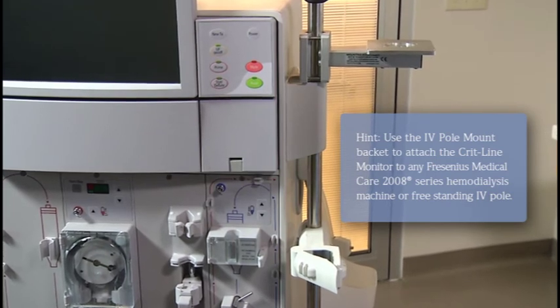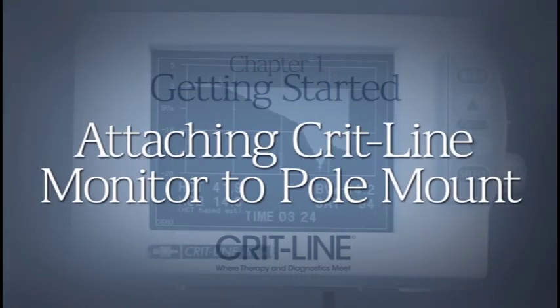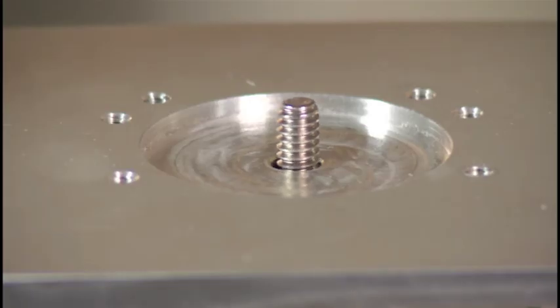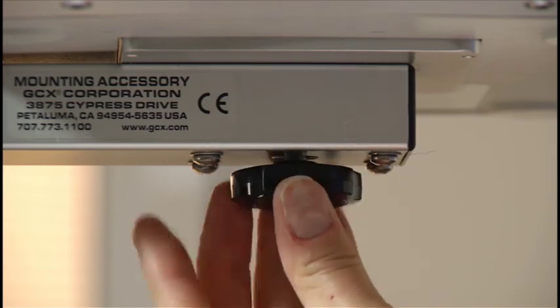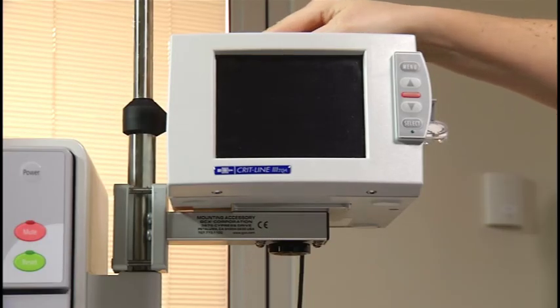The IV pole mount bracket can also be utilized on a freestanding IV pole — simply follow the instructions as noted. Insert the large black capped screw up from the bottom of the pole mount. Position the CRITLINE monitor on top of the screw so it lines up in the circle area on top. Tighten the large black screw by turning from below until the monitor is secure.